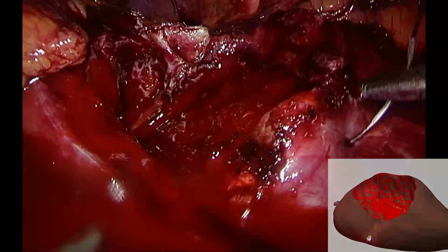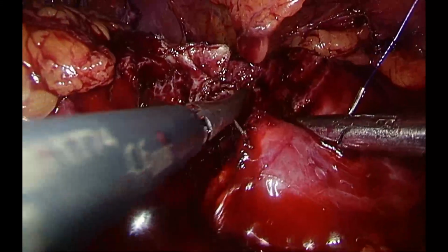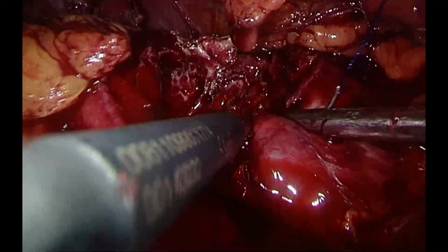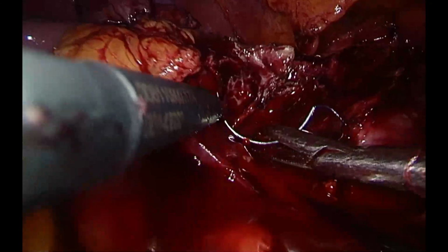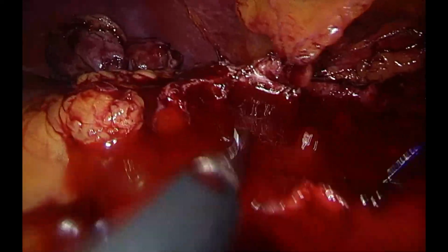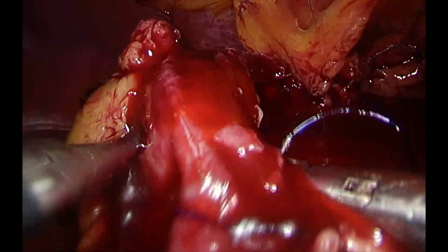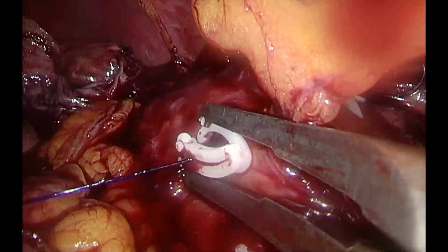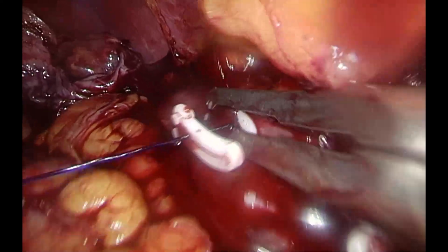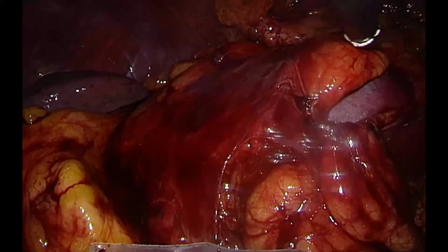Renorrhaphy was performed using a sliding clip technique with absorbable sutures. Fibrin sealant was applied over the closure, and perirenal fat was placed to reinforce hemostasis.